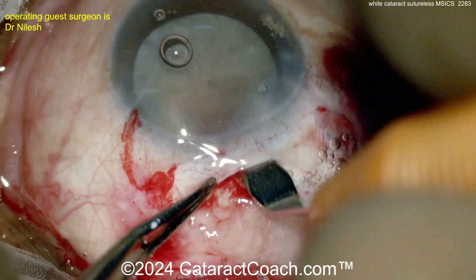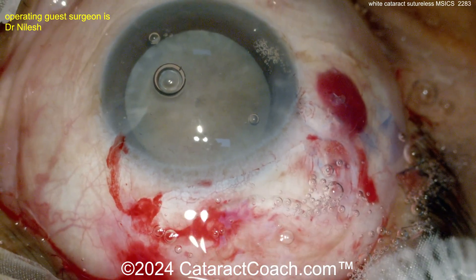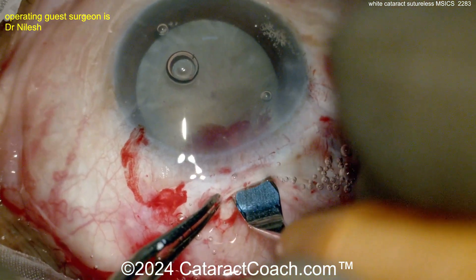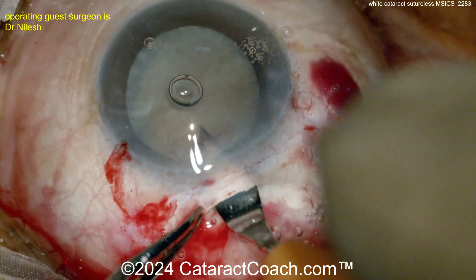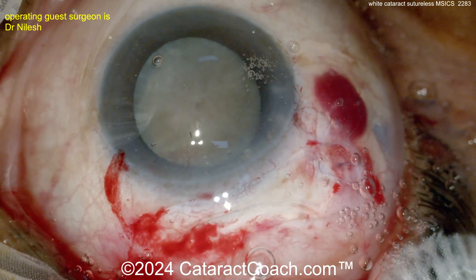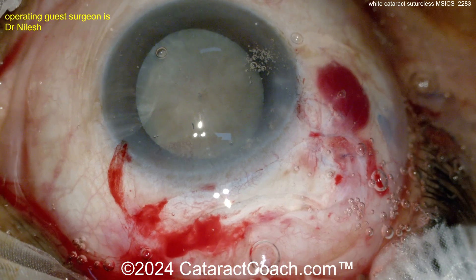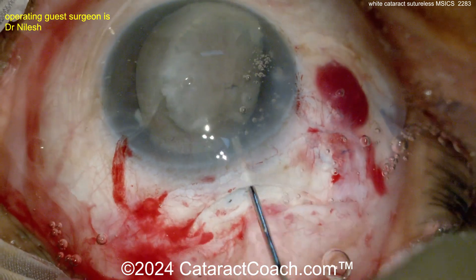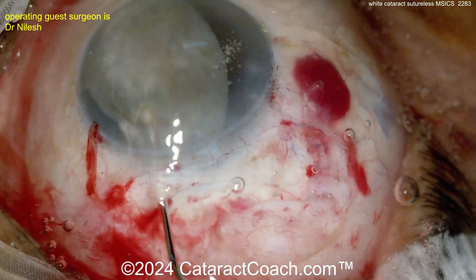Here comes the keratome entering inside the eye — you can see it's a pretty long tunnel length. Now going back in, entering the AC, and widening that up along the path already created. There's that big trapezoidal incision. Towards the center the tunnel length is maybe three millimeters, but out towards the periphery it's probably four or five millimeters because of the frown shape of the incision.